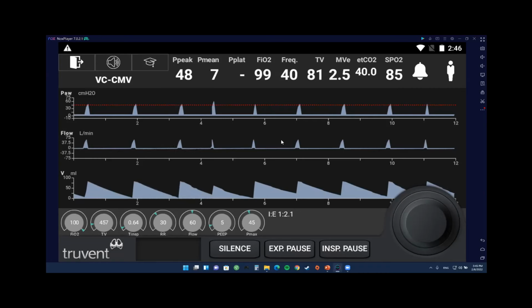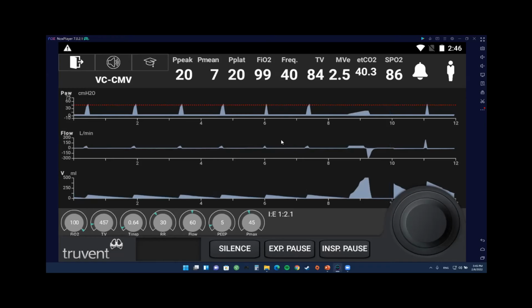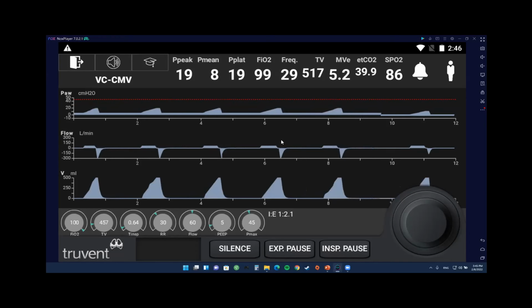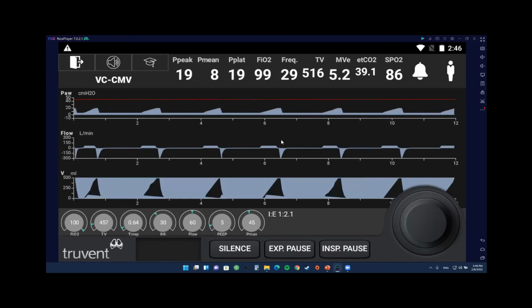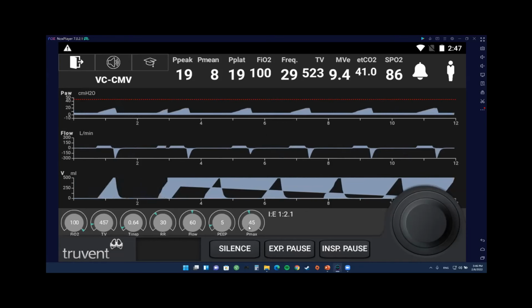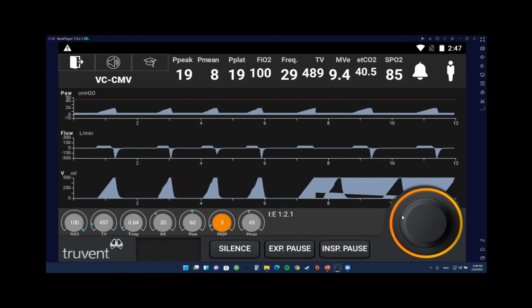So I would say we can try to modify the PEEP because normally in ARDS patients, we try to increase the PEEP, it could be 10, 8. Okay, one of the things you're bringing up is a very good point: whenever we have someone with an ARDS picture, we have to give them PEEP, right? Because how would you, Tyler, expect the compliance of that ARDS lung? Poor. Horrible, extremely low. So we need to help that compliance. And how are we going to do it? With PEEP. So, Sherelle, how much PEEP do you want? I would say 10. Okay, let's start with 10.